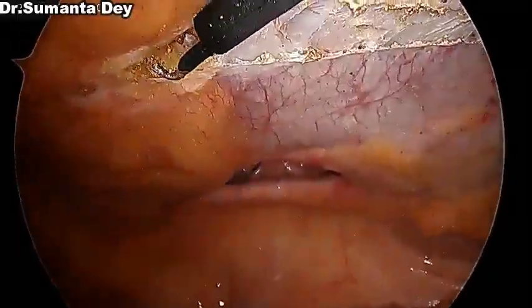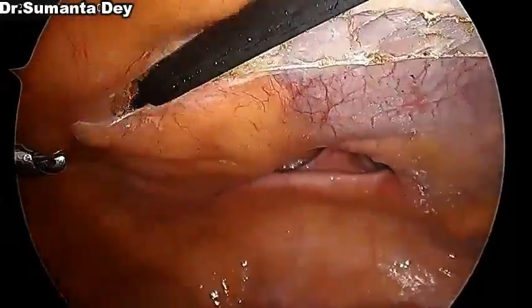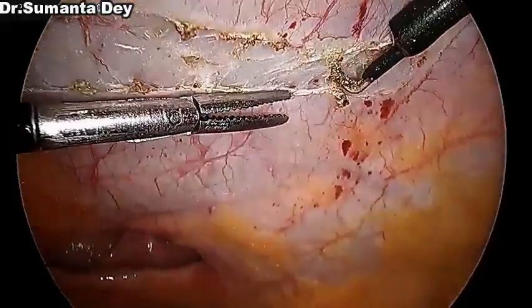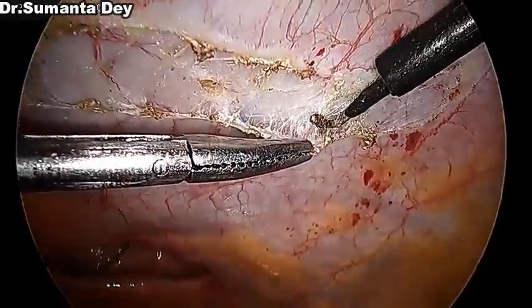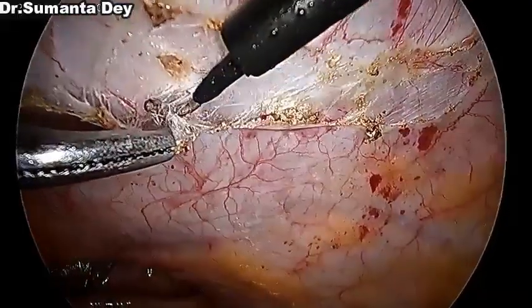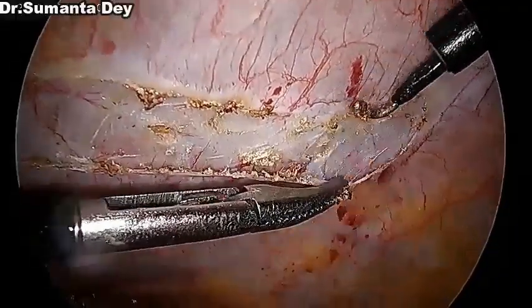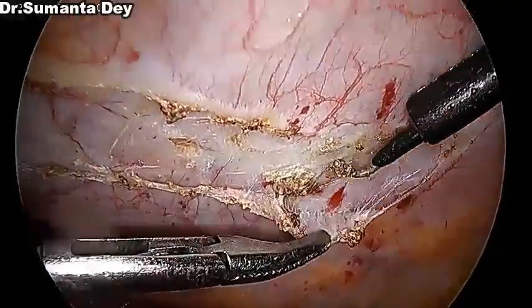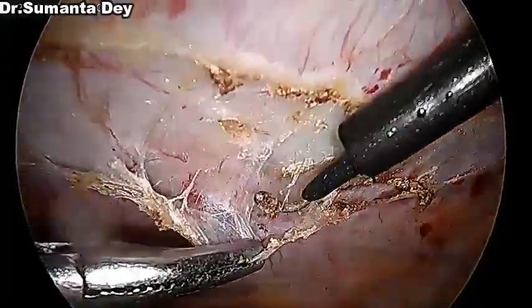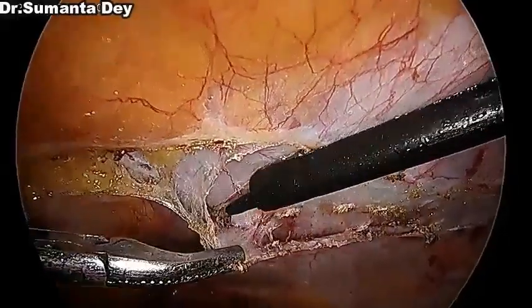And you can see while I am coming down towards the pelvis, the fat content is more, while in the upper part the fat content is almost nil. So here the peritoneum is thin, but with a good amount of gentle traction with your left hand instrument, and little bit careful cauterization and dissection with the back of the hook, you can lift up the peritoneum nicely. There you may find some small blood vessels which can bleed, but these are easy to control. So you can see gradually I'm lifting the peritoneum off the posterior rectus sheath here.